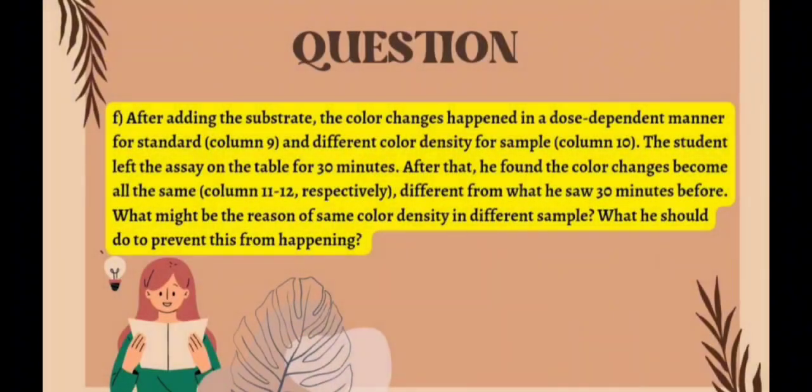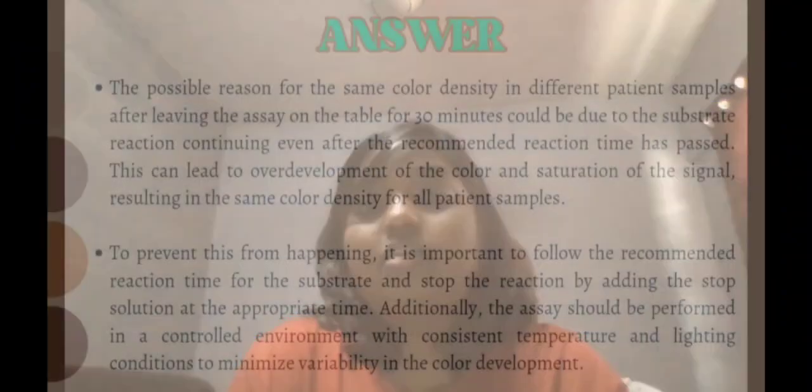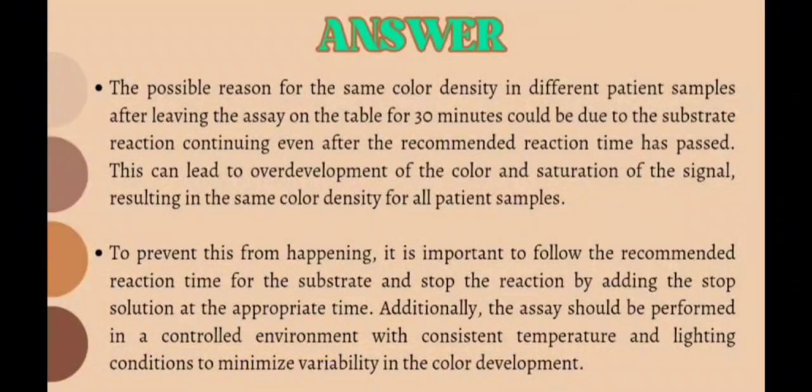The observation is that the color density in different patient samples remains the same even after leaving the assay on the table for 30 minutes. So this explains that the substrate reaction responsible for the color development in the assay could continue beyond the recommended reaction time. And this prolonged reaction time could lead to overdevelopment of the color and saturation of the signal, resulting in uniform color density.